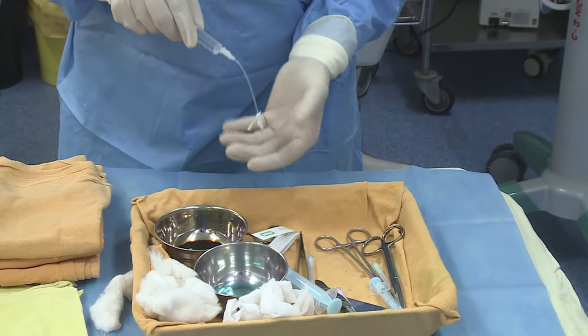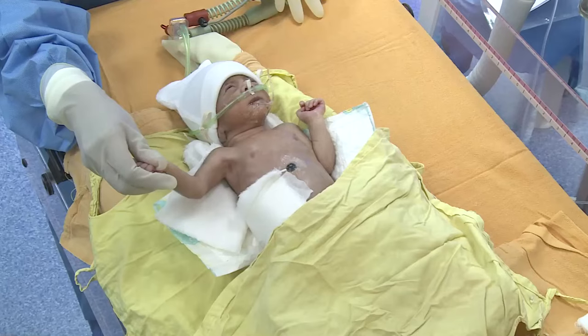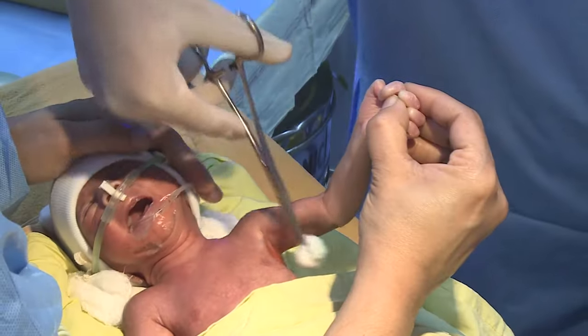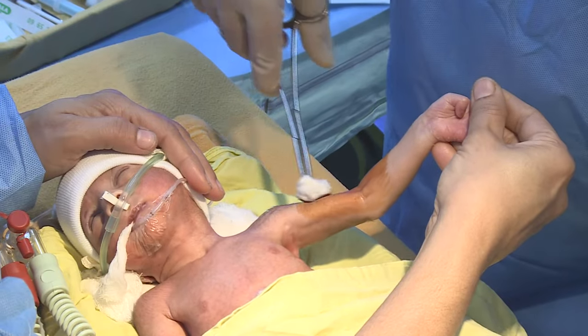Determine the appropriate size and type of catheter and flush the catheter using normal saline. Place the infant in the supine position. Prepare the site using the triple swab technique with spirit, betadine, and spirit, and also clean the entire limb.